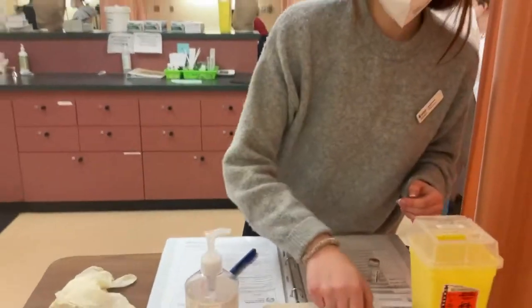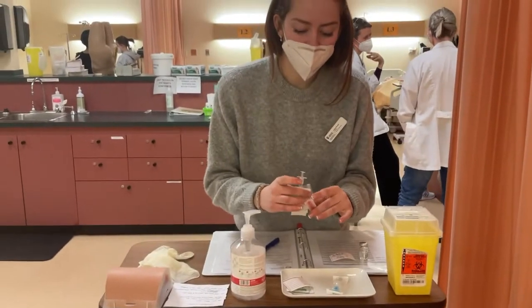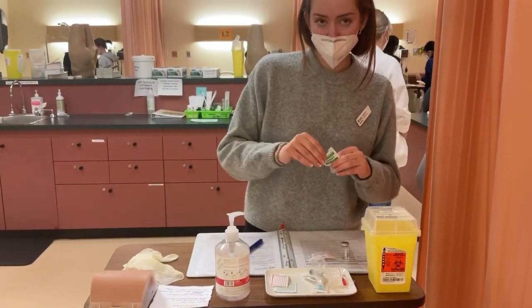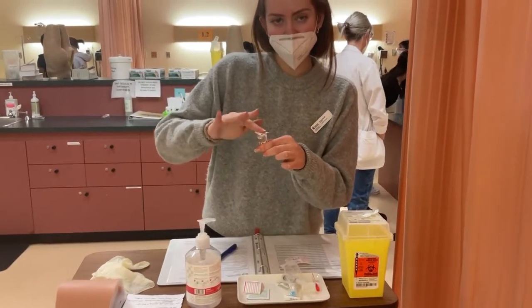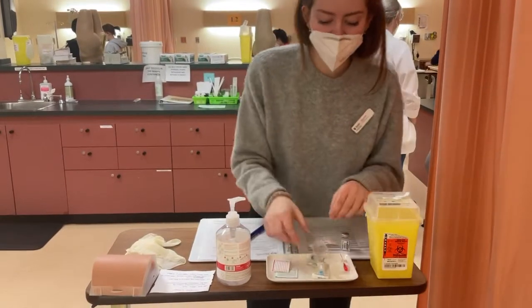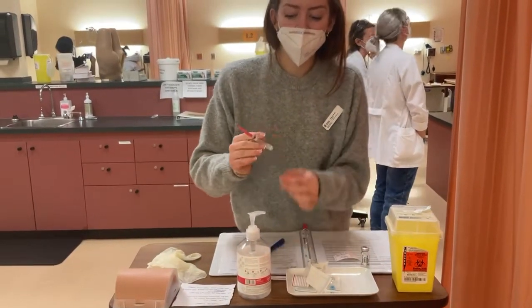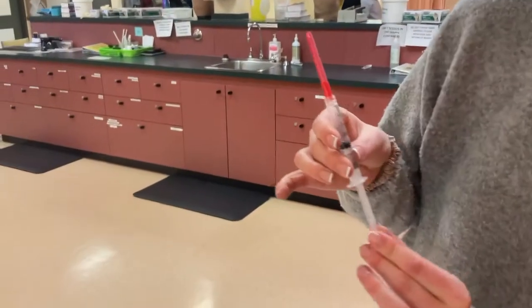So to begin, I will take my 3 milliliter syringe and attach it to my blunt fill tip. But before, I will sanitize my vial for 30 seconds in a circular motion, getting the pad and working through the head as well. So I'll let that dry. I'll connect my syringe to my blunt fill needle. I will pull up the dosing, which is 2 milliliters.